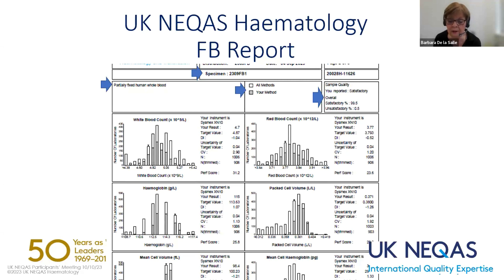And it will show you a summary of the performance of the actual sample quality and what you reported. And also you'll see there the overall satisfactory performance.